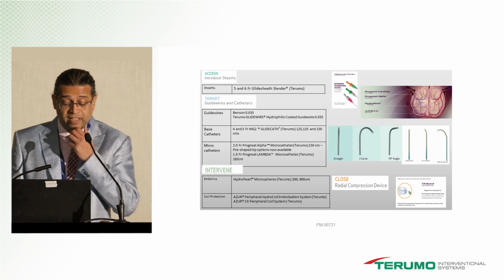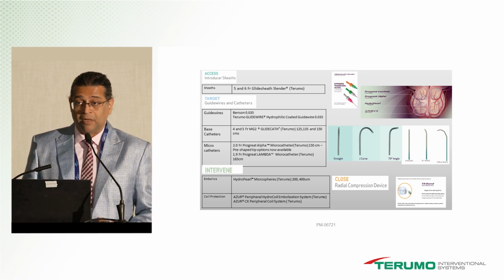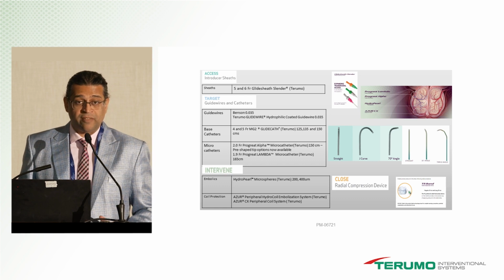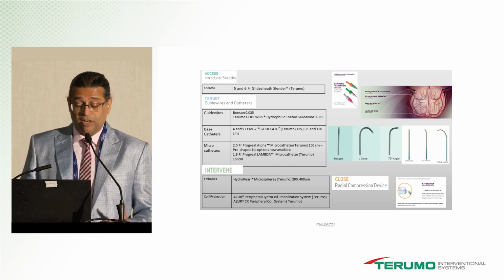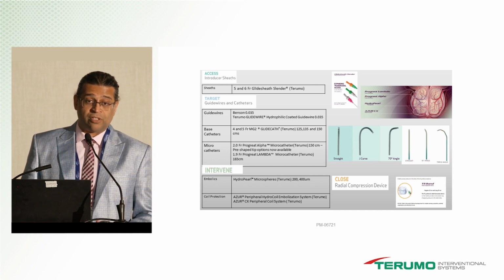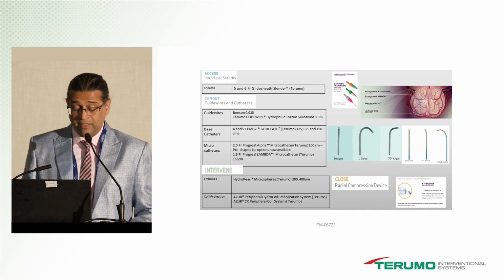For PAEs, I essentially start with 200 first, unless it's a huge prostatic artery. I start with 200 and then may go up to 400 if needed. Or if there's a collateral going down, I may start with the 400 itself, just to avoid non-target embolization. So those are essentially the sizes of the particles that I use.